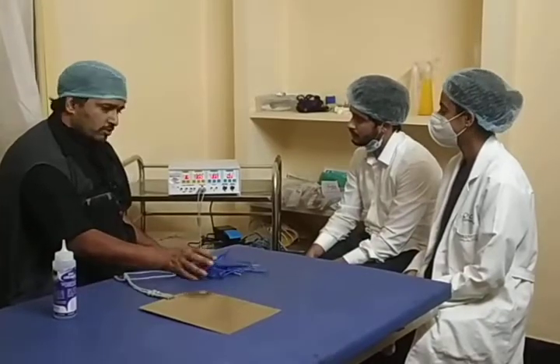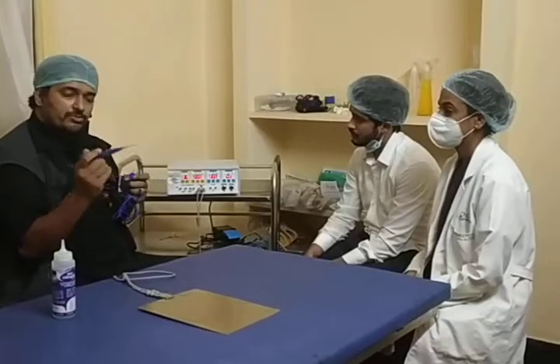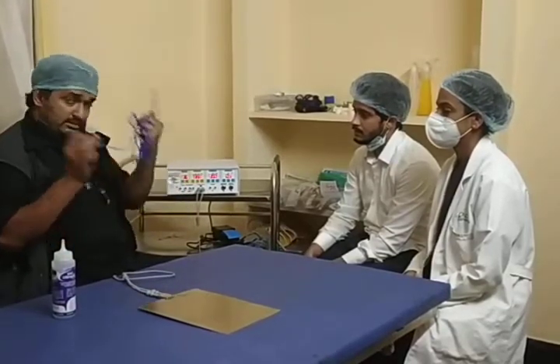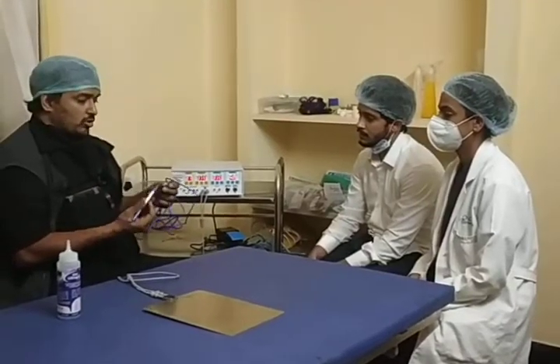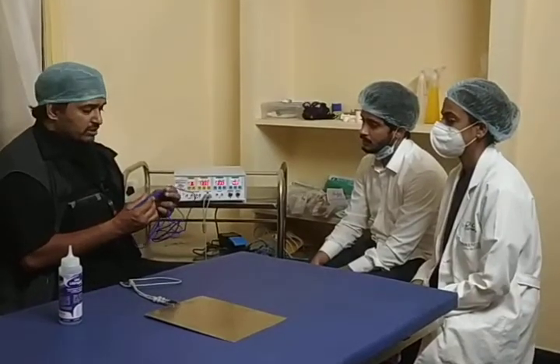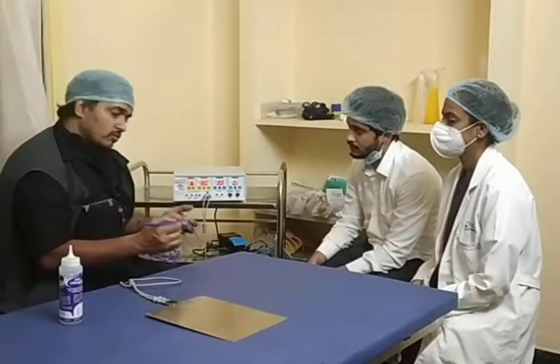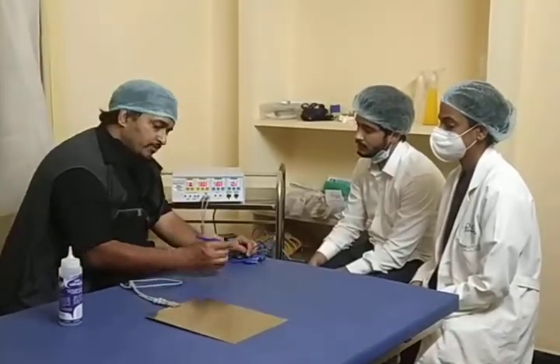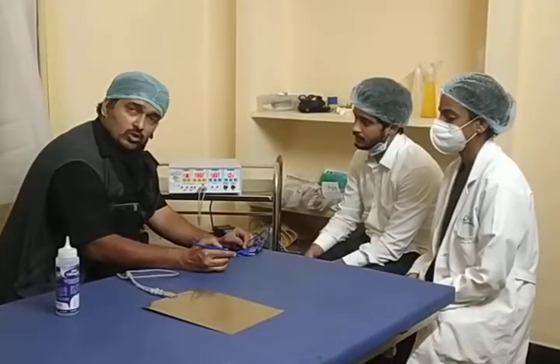So let me go through it quickly. I usually prefer the hand operated option. This is called a unipolar. These are autoclavable and these are available as disposable options as well. So these can be autoclaved, these can be cleaned. Once you are doing a procedure, you can just attach it over here. There is a cut option over here and there is a coagulate option over here. So when you are doing surgery with proper surgical attire on a patient, you are in a position to do precisely either cut or coagulate, one thing at a time.